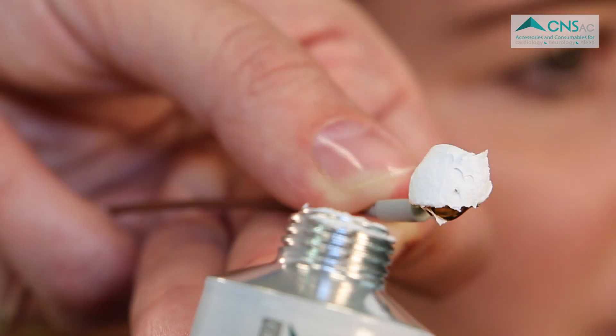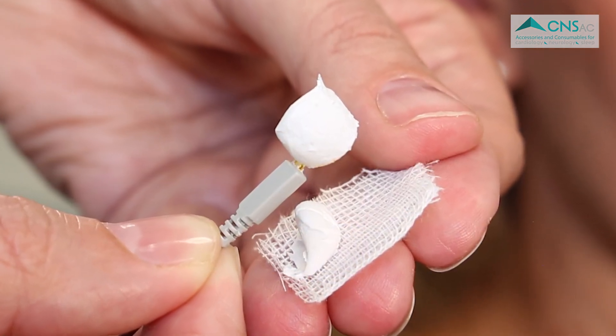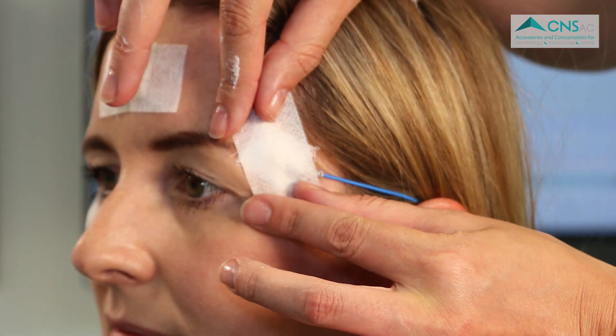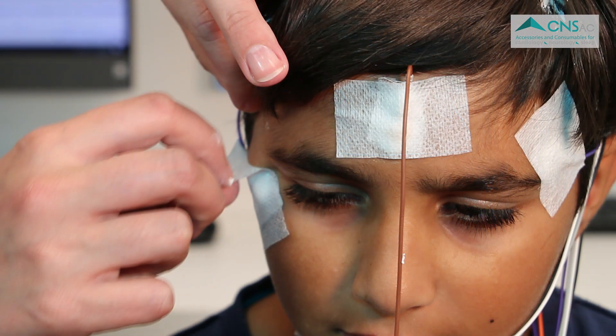Due to EEG ACP's adhesive properties, it is an excellent alternative to collodion, thus making the application and removal of electrodes easier for both patients and medical professionals. EEG ACP has a short drying time and provides excellent signal quality. It can be used on both adults and children.